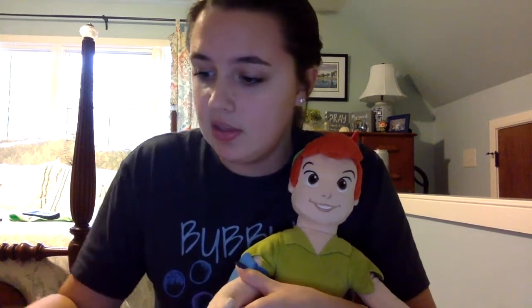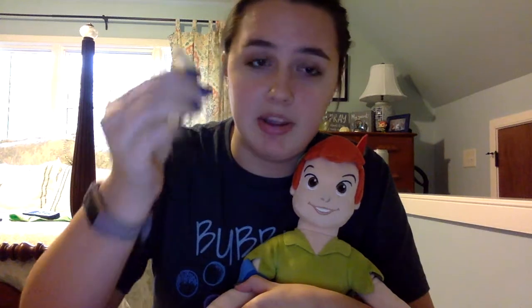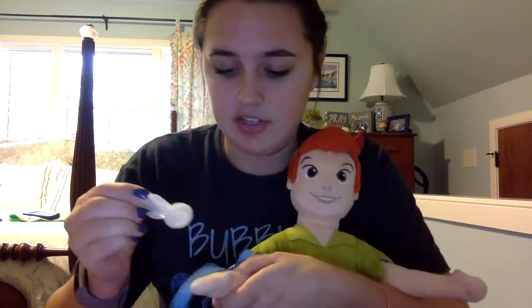Then they're going to take this special soap right here that looks like a stick figure, and they're going to clean off your hand. So this soap right here makes a little clicky noise, and then all the soap is going to come out of this spongy area. And they'll take it and they'll clean your hand or your arm wherever they're going to do the poke.